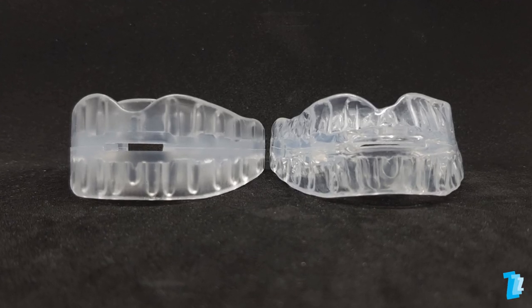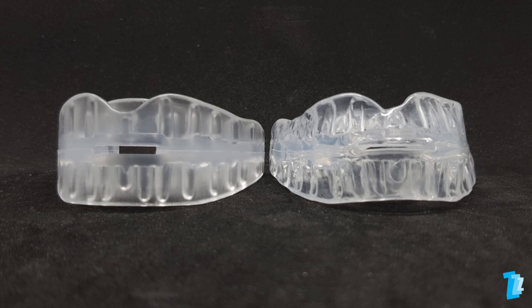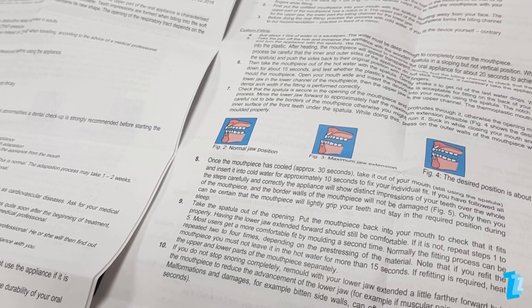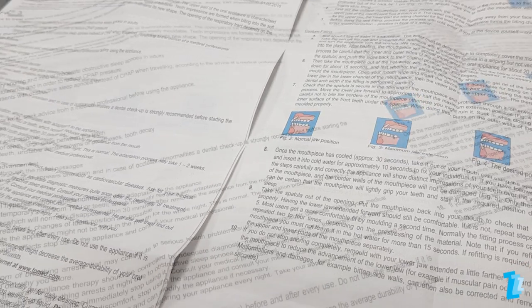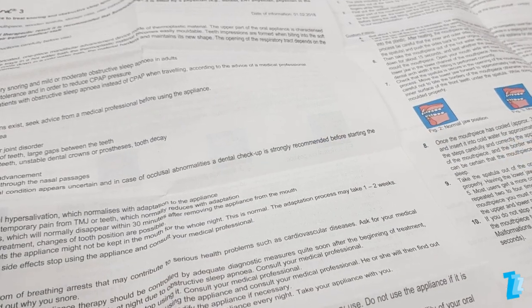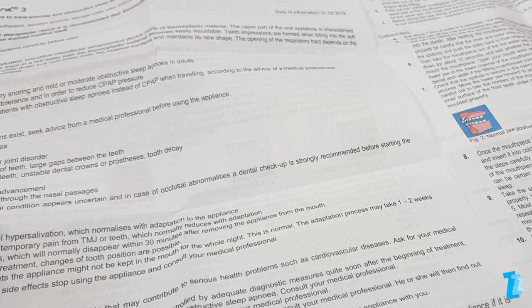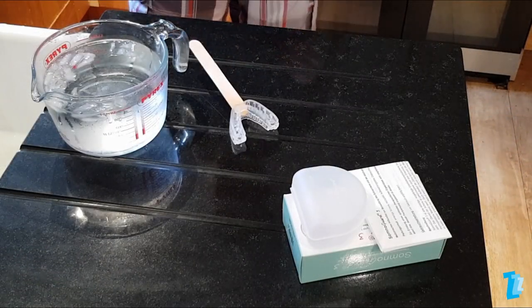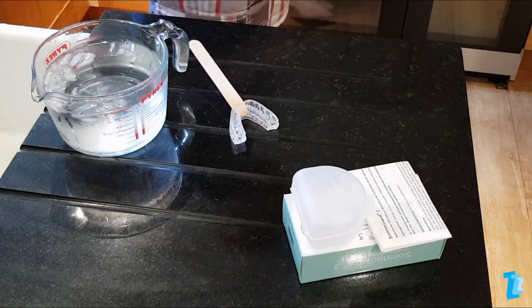Here we show you how to mould and fit a Tomed Somnugard III mandibular advancement device. The process, at first glance, may appear somewhat daunting as the instructions are very comprehensive. With some simple preparation and sufficient care at key stages of the process, fitting this device is actually relatively easy.